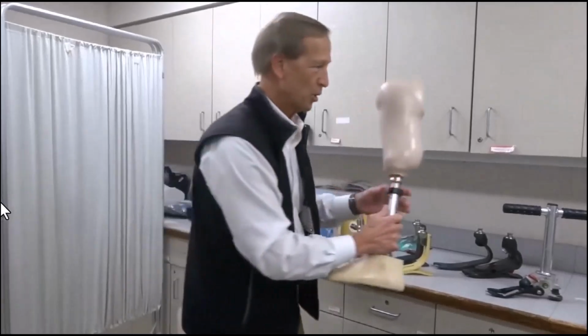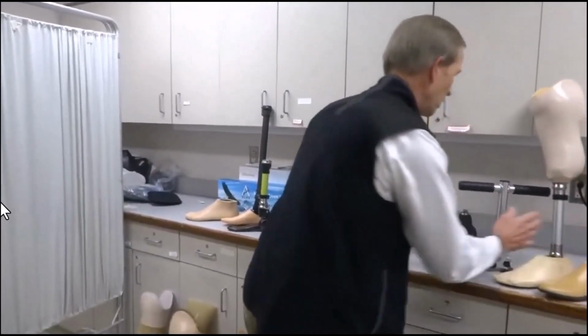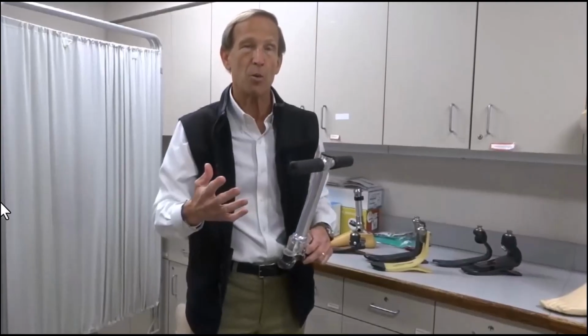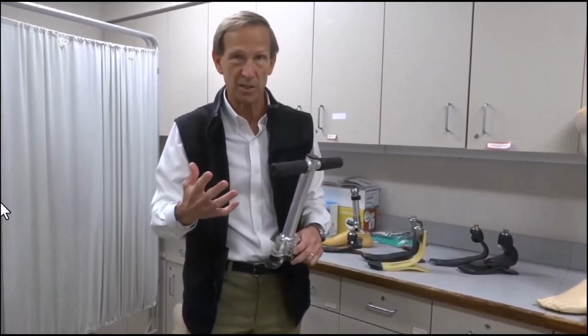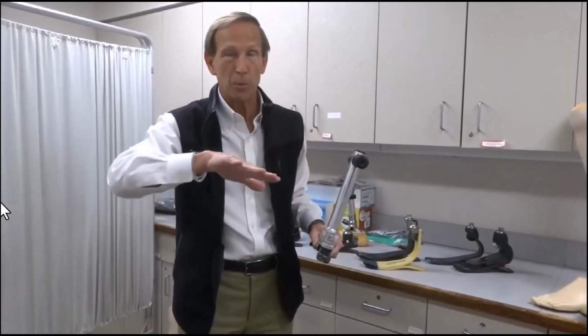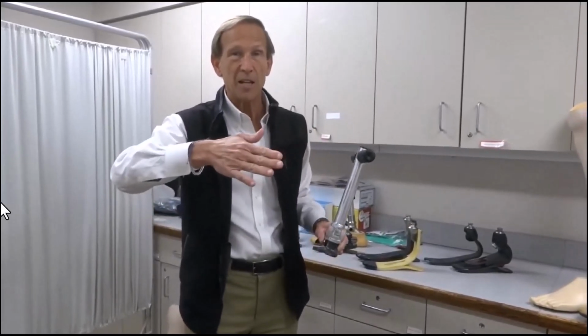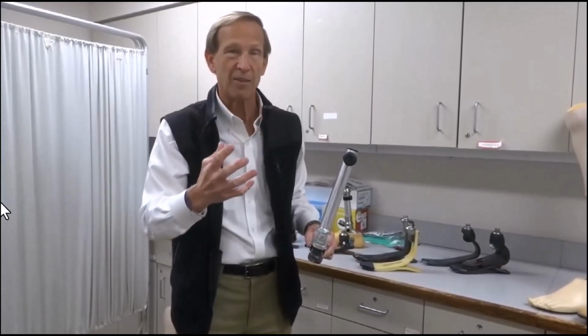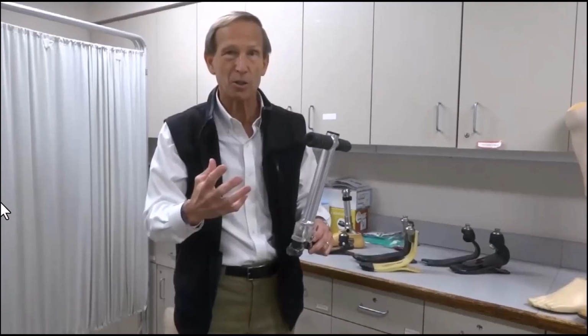Now, once you start to go outdoors, you encounter uneven terrain. Now all of a sudden there's going to be lumps and bumps, little hills and inclines, and now we have a couple of choices. There are what we call multi-axis feet, feet that will not just go up and down like the first ones we saw, but will tilt a little bit side to side and maybe even rotate a little bit. And multi-axis feet typically have a way of sort of bending in different directions.